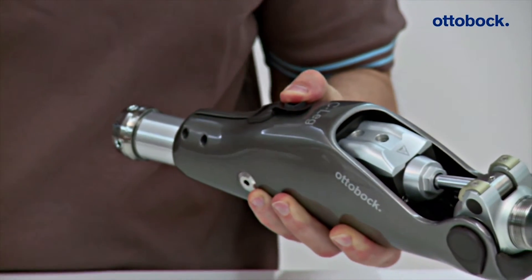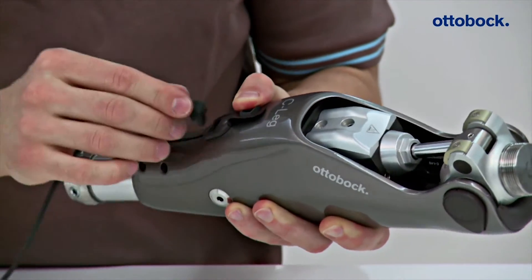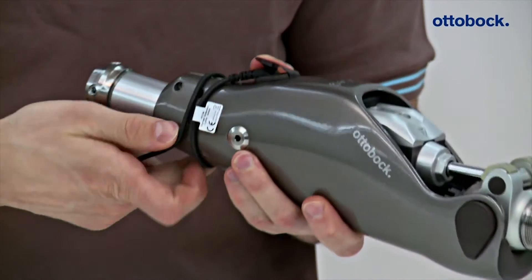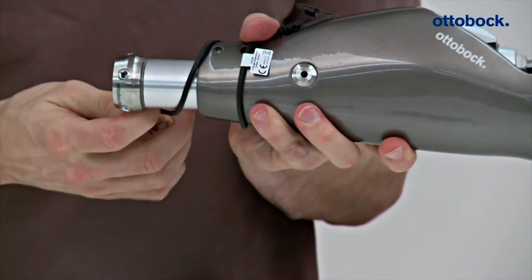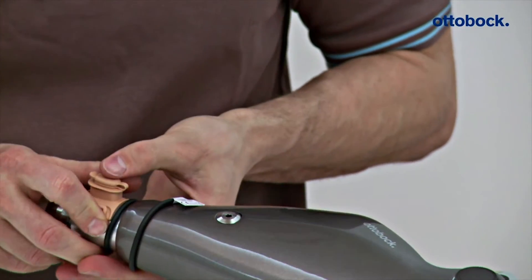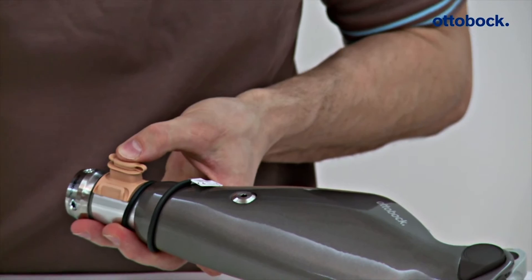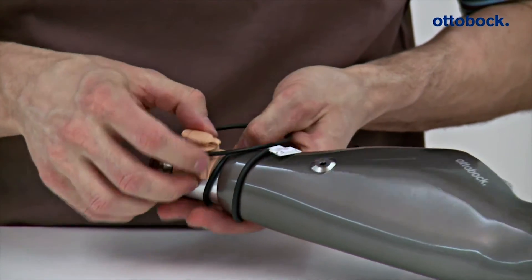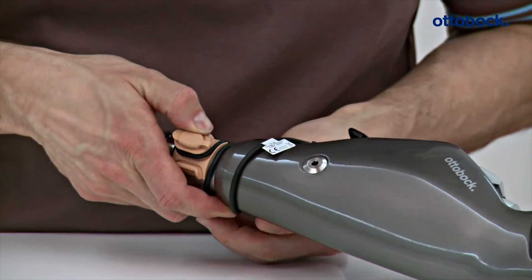Installing the 4X156: First, the O&P Professional opens the cover of the charging receptacle on the knee joint and then plugs in the charger extension cable. Next, the cable is wrapped around the tube adapter. The O&P Professional then positions the bracket of the charging receptacle on the tube and secures it with the corresponding O-ring.